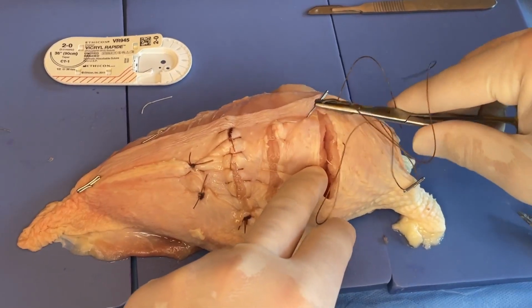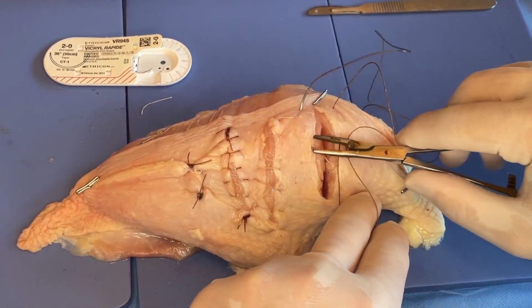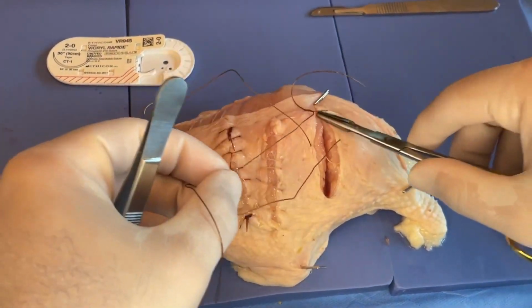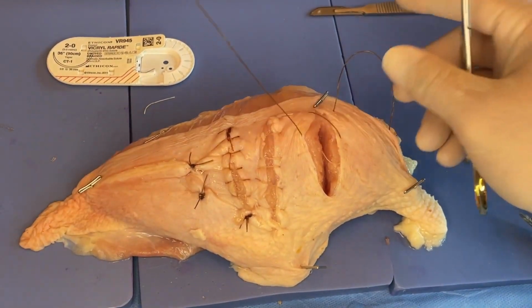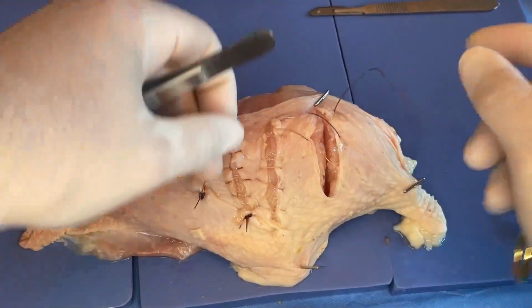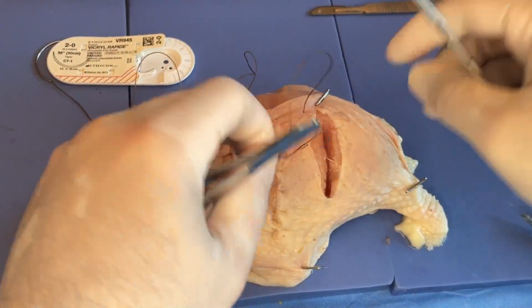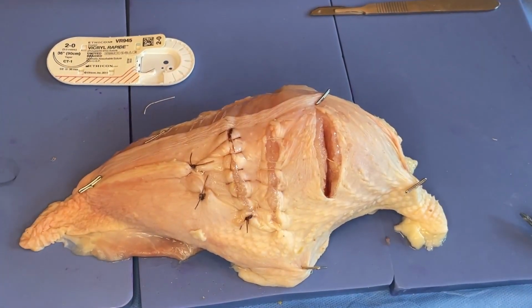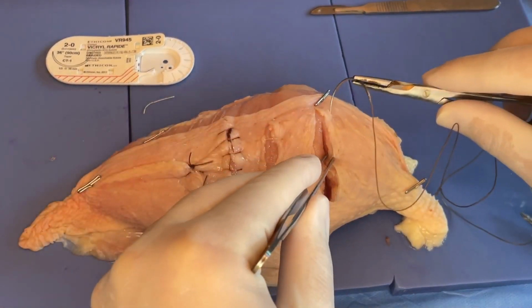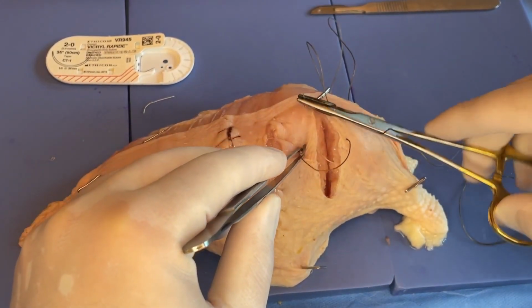If we did that, if we came from here and popped through like such, we would actually be creating a figure of 8, which we had just done in the previous video. So you can see here, and then if we tie that, we've got our figure of 8, our X pattern there. So that's not how we do that. I do see a lot of people in their beginning suturing experiences who kind of mix that up. So again, first bite here, parallel, and we're not actually passing through the defect itself.